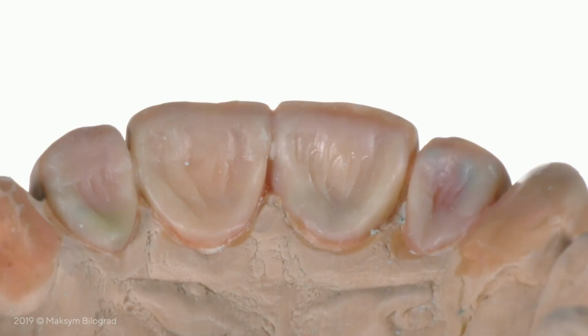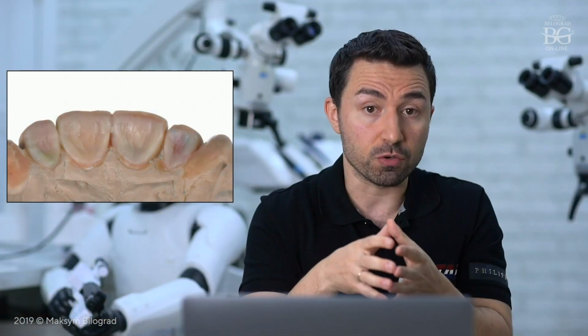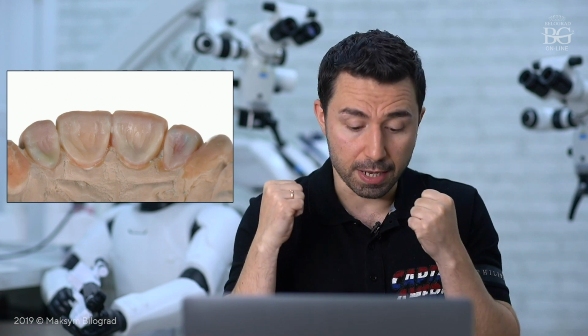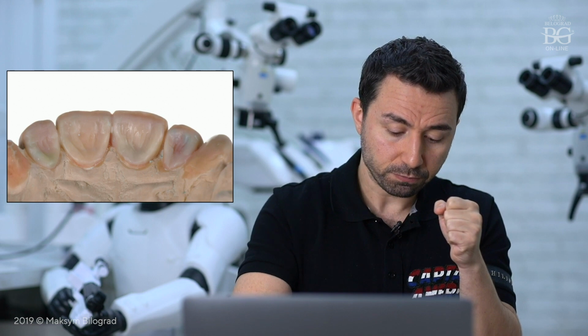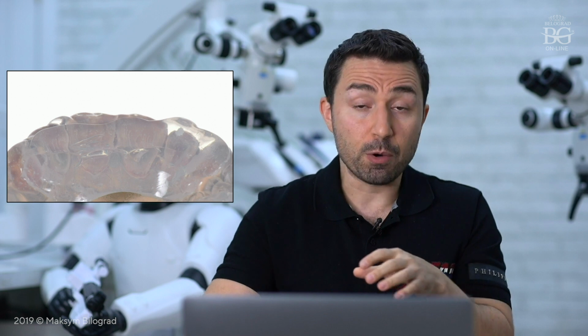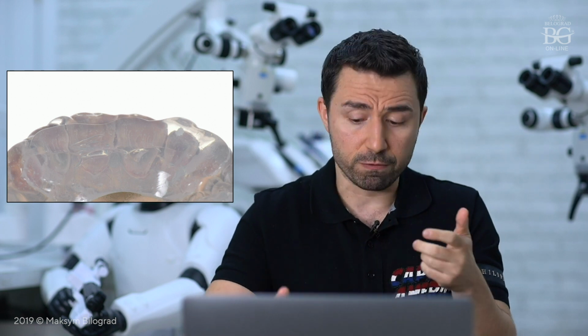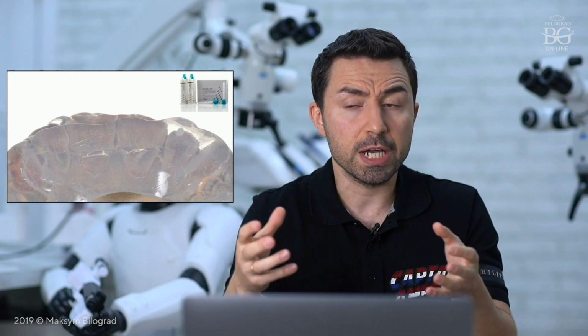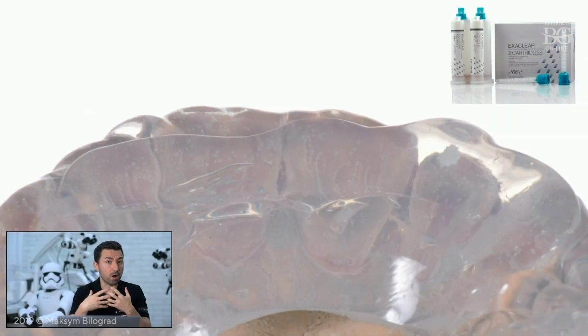In our case, we decided to do this transitional bonding technique as the final restoration, utilizing a normal, packable restorative composite material. So we took impressions from the wax-up using a transparent silicone index. Nowadays you may find different brands of transparent silicone index. You can find them from GC, from Ivoclar, from Micerium, from Germag. So basically there are a lot of different types of transparent silicone that you can utilize on a regular daily basis.